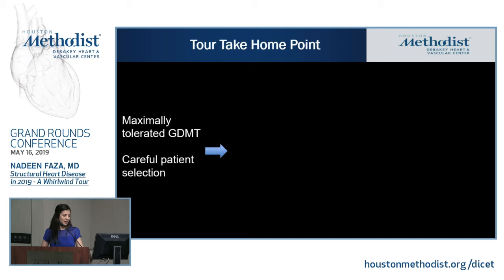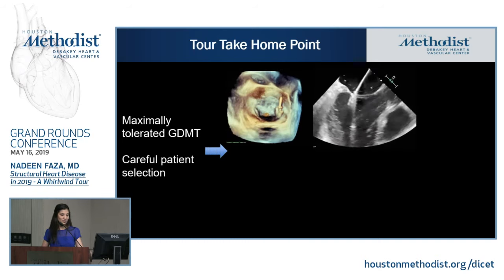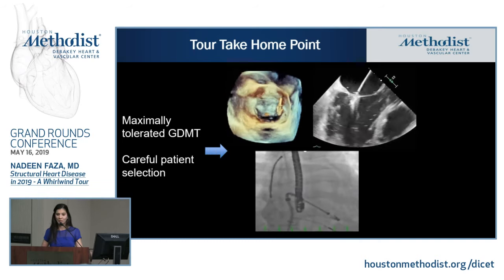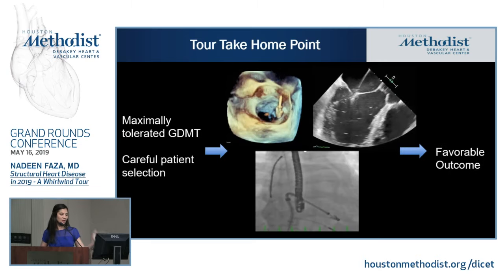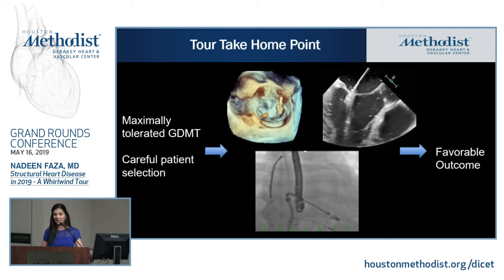If it doesn't, then we have a solution right now. We can perform the MitraClip procedure for favorable outcomes. But just skipping to a MitraClip procedure is not the answer, and the trials have demonstrated that. We should keep that in mind.